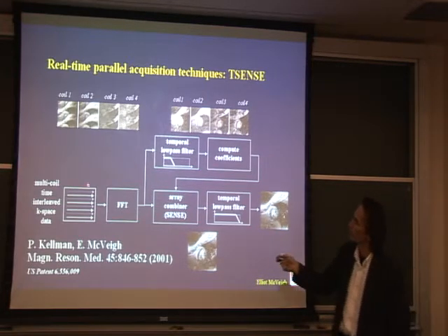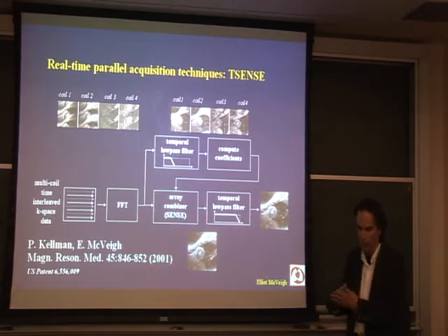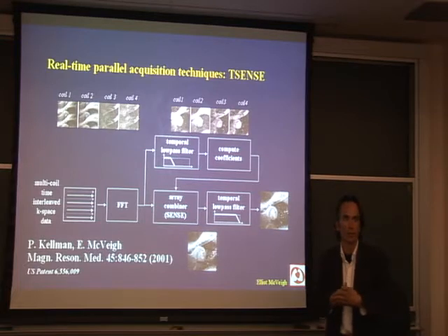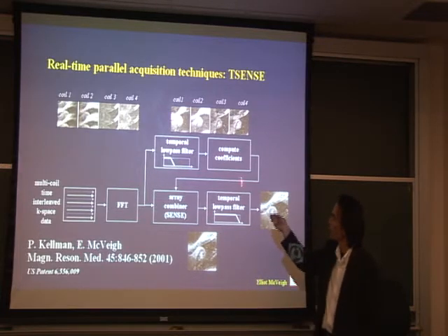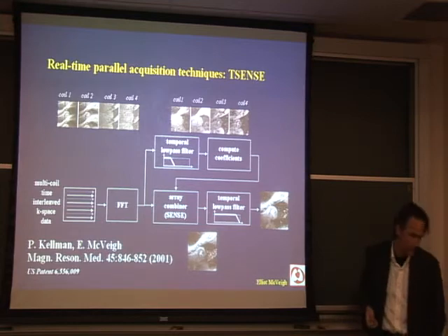The reason we want to do this in a time-efficient manner is because when you're doing real-time MR guidance, you're changing the scan cycle. So you're pushing around and you have to say, what are my new coil coefficients? You have to measure them this way, get them back into the reconstruction, and get them the same optimal.